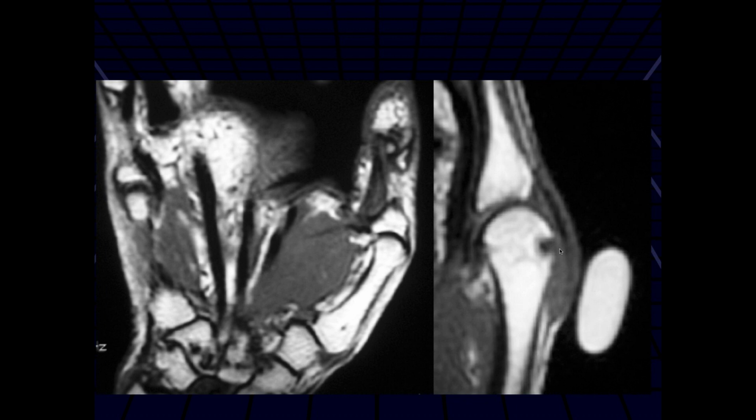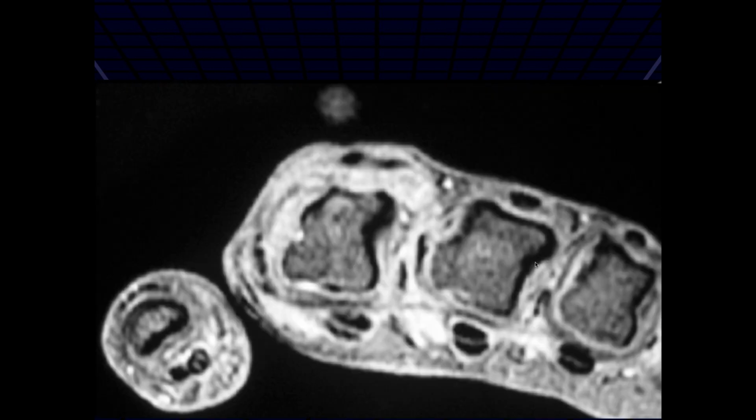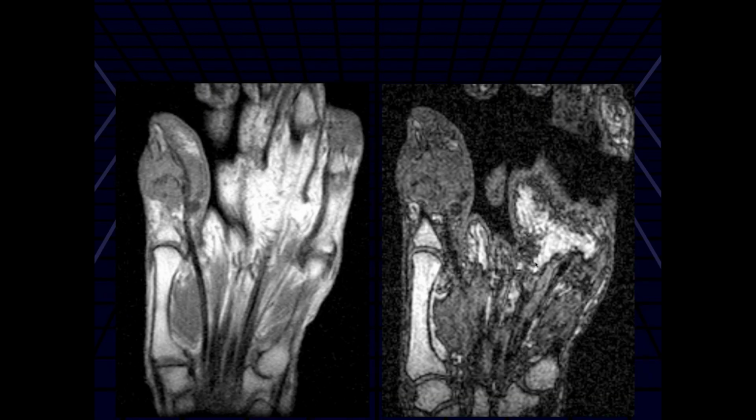We have a soft tissue skin marker overlying this metacarpal head, and there's this low intermediate density soft tissue right there, in between the extensor tendon and the metacarpal head, with a small erosion. Now we see this on the axial involving the second digit. It's in between the tendon and along the bone. It might just be focal synovial thickening with erosion, similar to the one Ashu had, the tophaceous little gout. Right, Ashu?